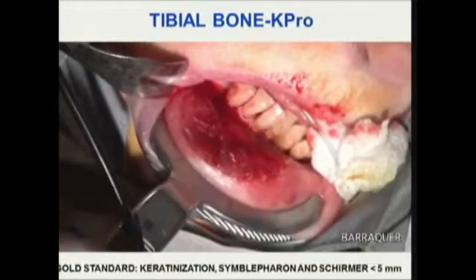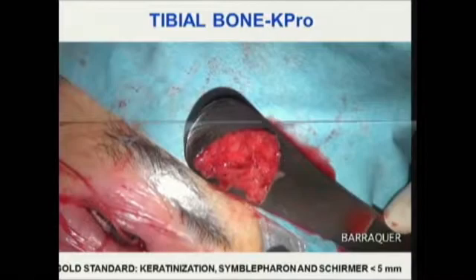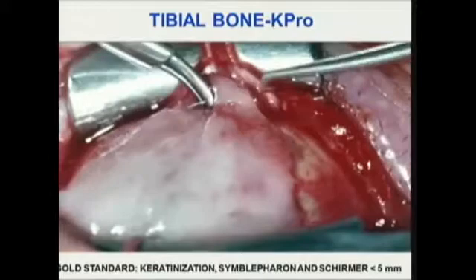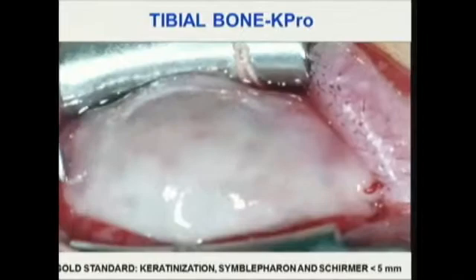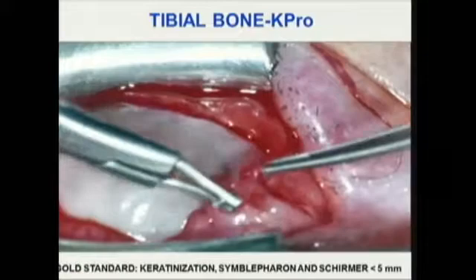Then the minor salivary glands are trimmed. The oral mucosa is sutured first to the four muscles in order to improve the vascularization, and after that in 360 degrees around the sclera. The remaining conjunctiva is sutured over the oral mucosa graft.